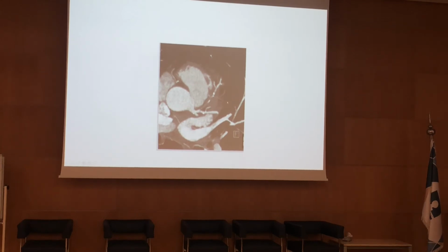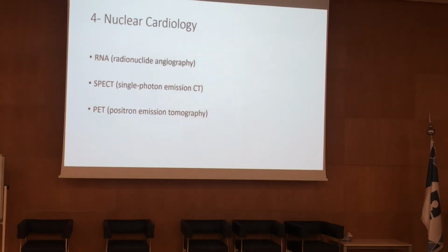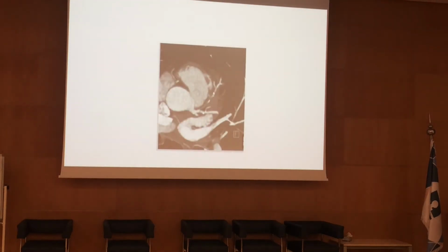So this is just an example of the utilization of cardiac CT. We use it for anomalies, assessment of coronary artery disease, assessment of the chambers, function sometimes if we need it, and the vessels, pulmonary veins, especially for AF studies and ablation.